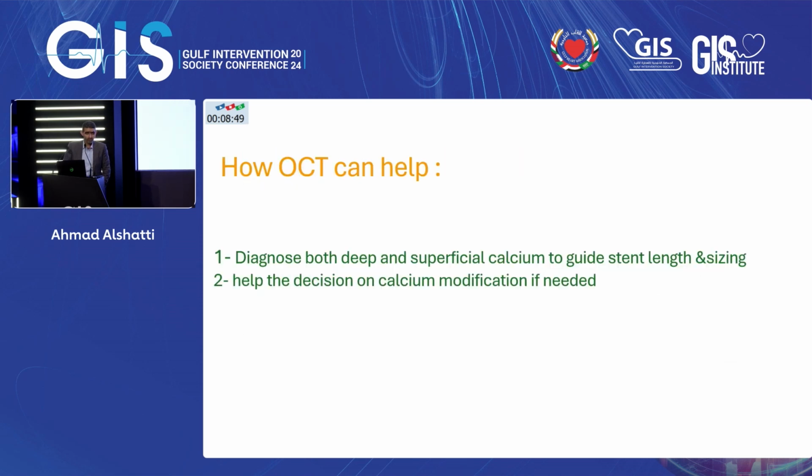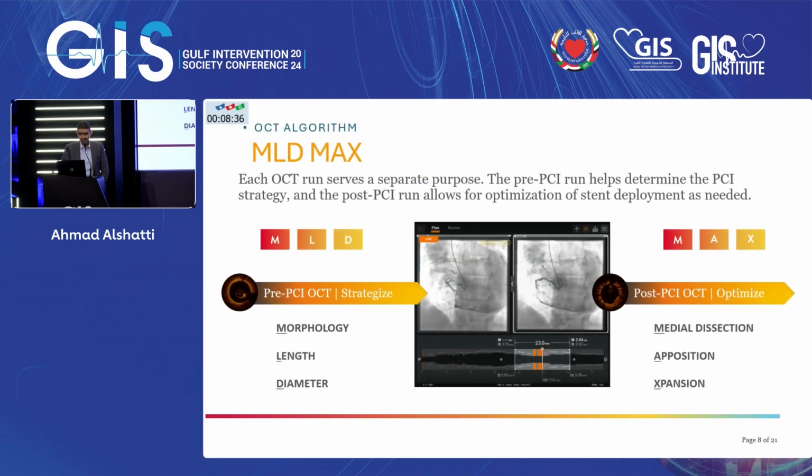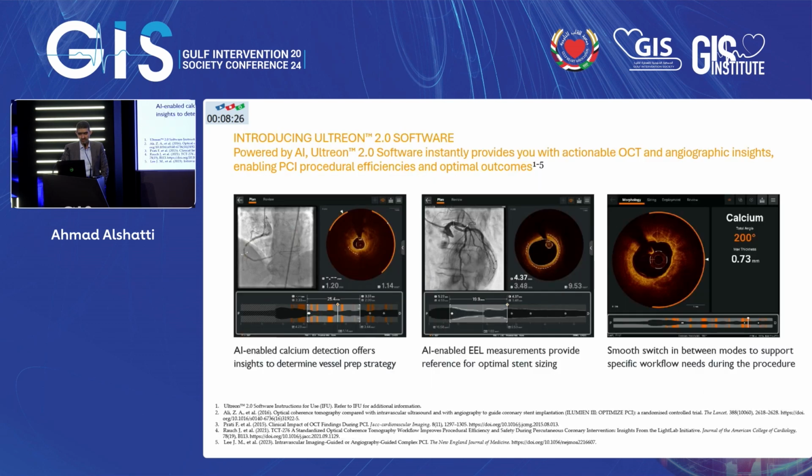So how can OCT help in delivering those things? It can diagnose both deep and superficial calcium, and it will help us decide if we need calcium modification or not. And this is through MLD MAX, which was shown repeatedly today, but mostly with the pre for morphology, length and diameter, and then with the MAX afterward.